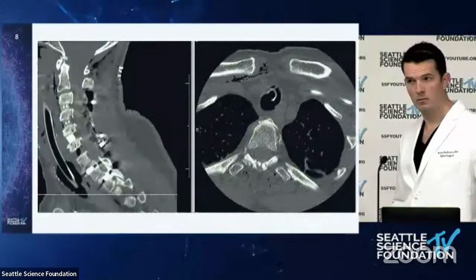Yeah, I mean, for me, even if you look at the C5 nerve root, there's not a lot to decompress; you guys got a beautiful realignment. It's just one of those nerves where the teaching was that the C5 nerve root has some funky anatomy and all this stuff, and none of that turns out to be true.